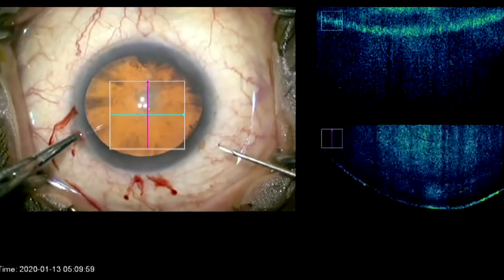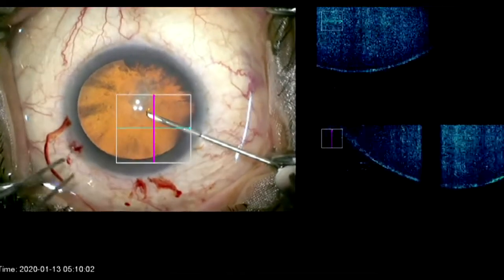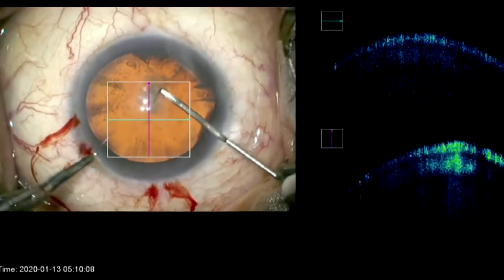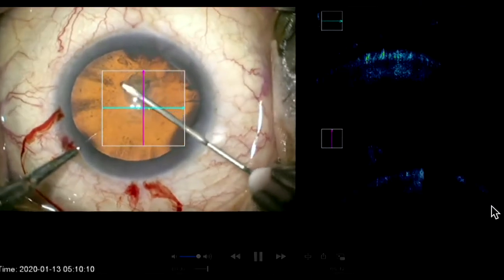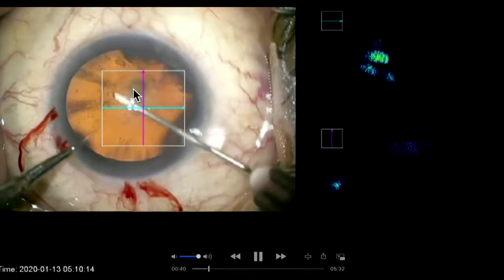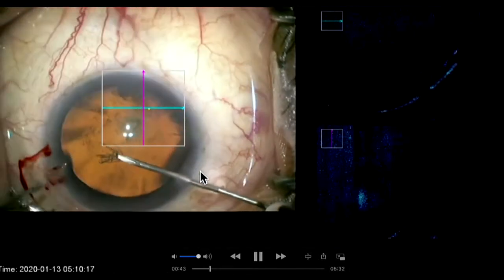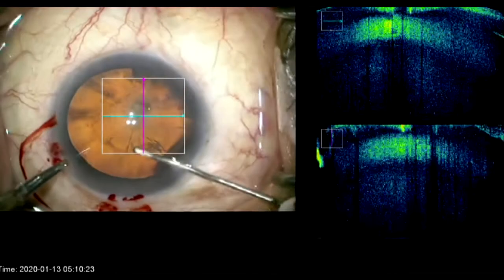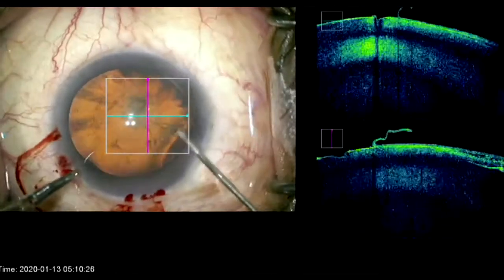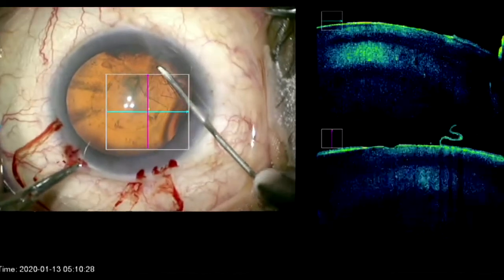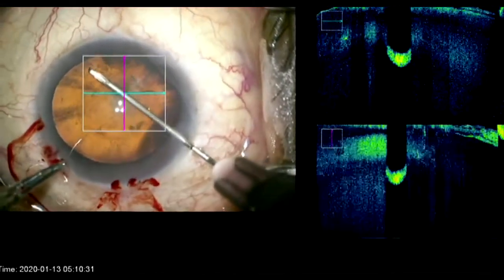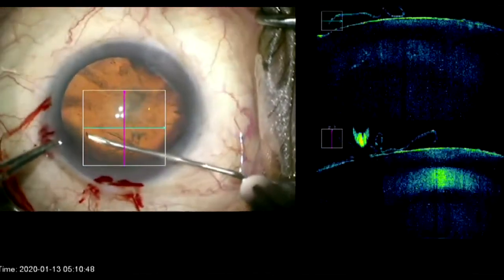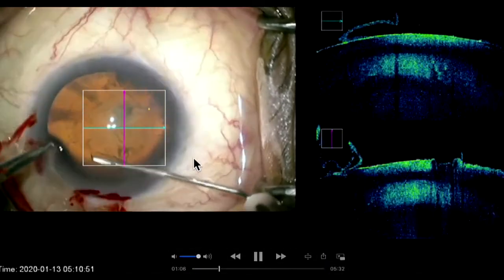Once you fill the anterior chamber with viscoelastic — which should be clear, transparent, and should retain the intraocular space throughout your capsulorrhexis — you can see this is the anterior capsule under viscoelastic. I'm doing the side port, which gives access to maintaining pressure on the anterior capsule with no leakage of viscoelastic. You can very easily do a capsulorrhexis with a needle cystitome. But if you are using a capsulorrhexis forceps through the main port, the viscoelastic leaks out and you have to refill multiple times. Nowadays you can also get micro-forceps with which you can do a good capsulorrhexis through the side port.